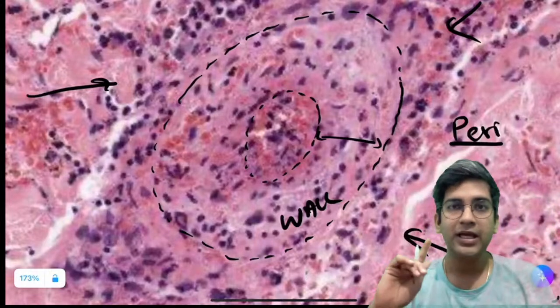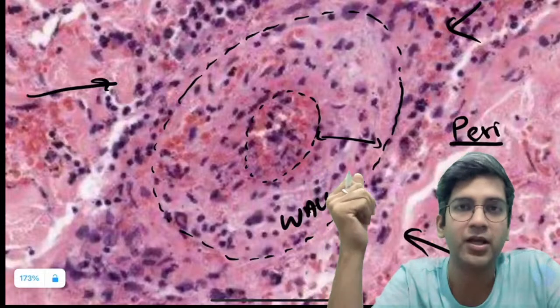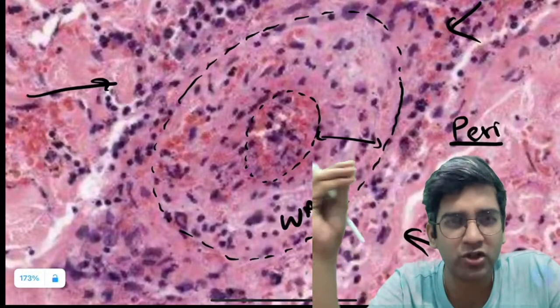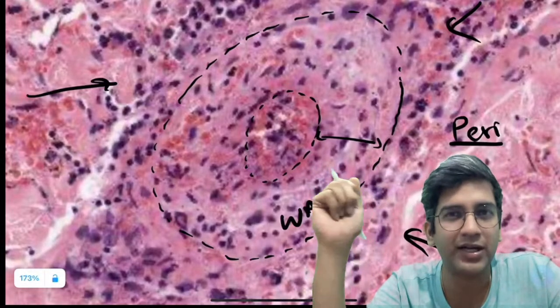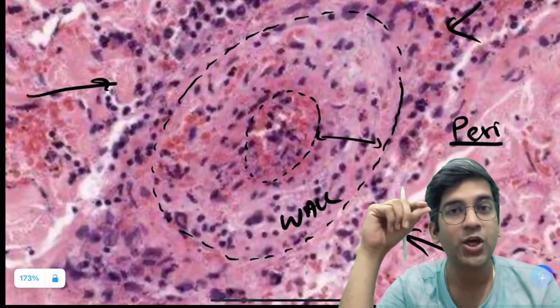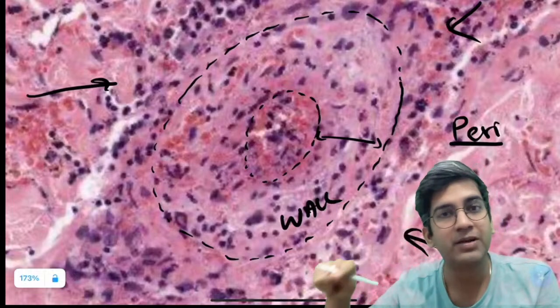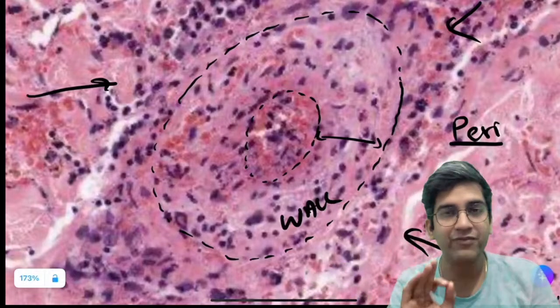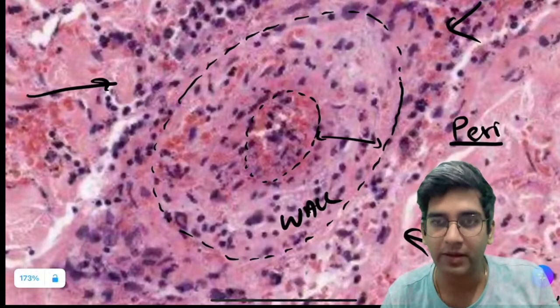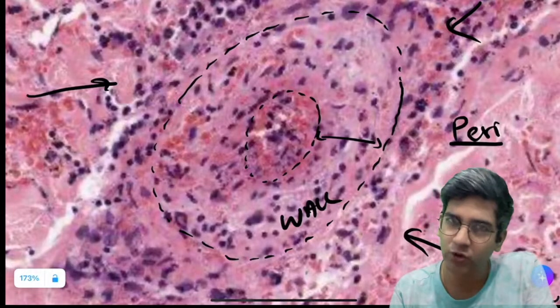Perfect. Now, let's go to a simple first-year slide which I've seen. I'm sure you must have demonstrated in your pathology practicals to your undergraduates: appendicitis, I will call it appendicitis only when the inflammatory cells, that's the neutrophils, travel to the muscularis propria of the appendix. Have you told this to your undergraduates? Yes, no, maybe. Possible? Have you told this to your undergraduates?